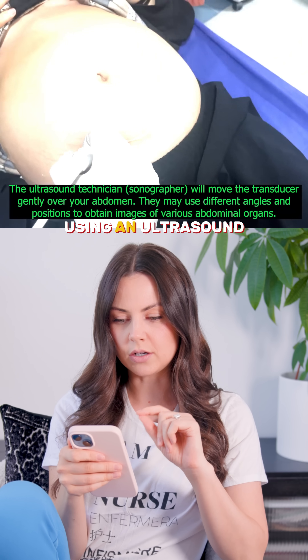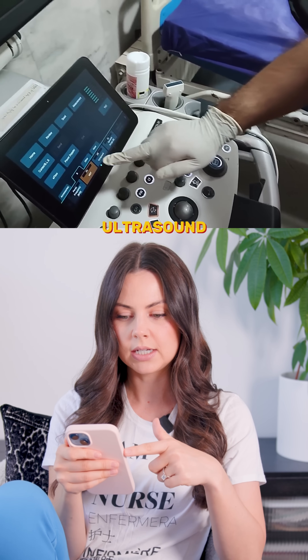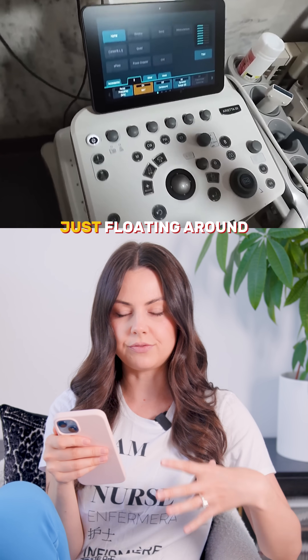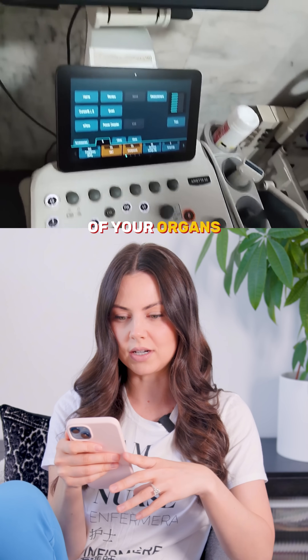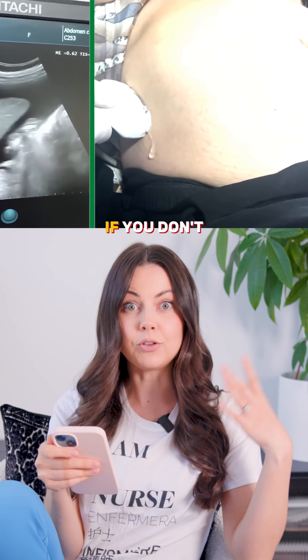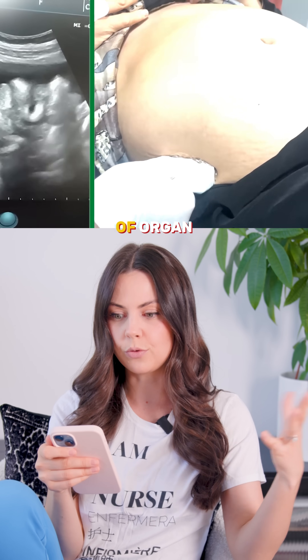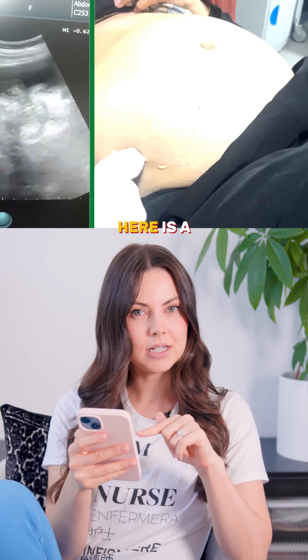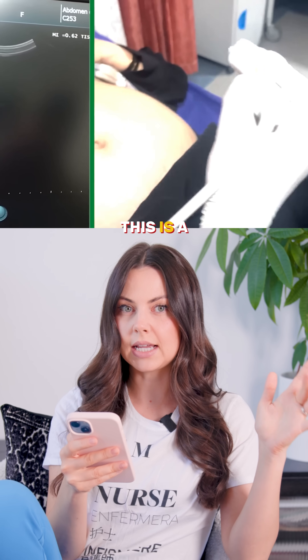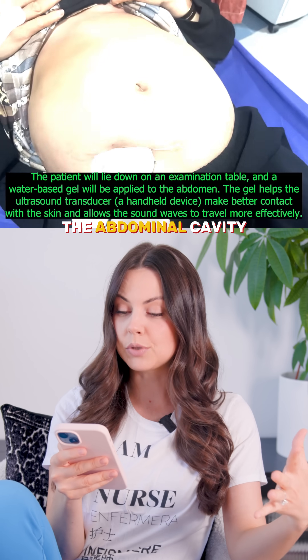You can see that they are using an ultrasound during this process. If you weren't to use an ultrasound, because everything is just floating around — obviously you have all of your organs in the abdomen — if you don't use an ultrasound, you will potentially be poking through some sort of organ. What you guys are seeing here is a paracentesis, a procedure essentially to drain the excess fluid in the abdominal cavity.